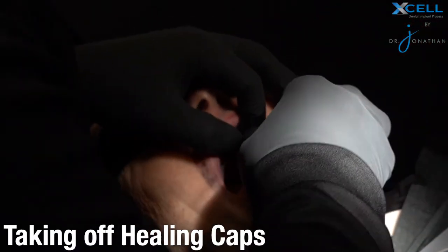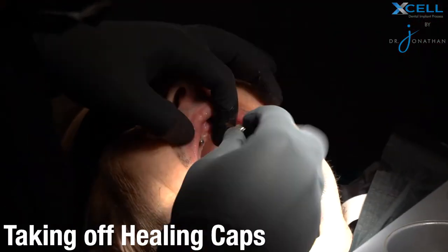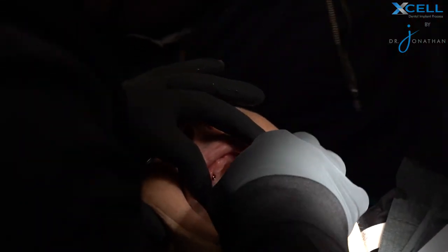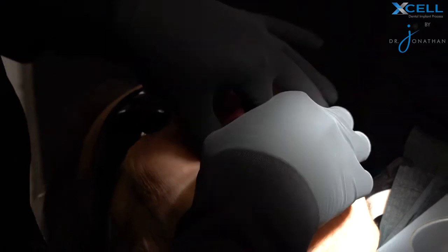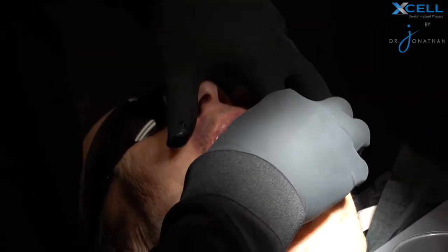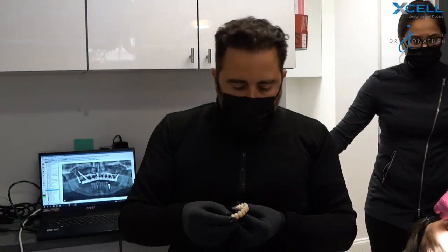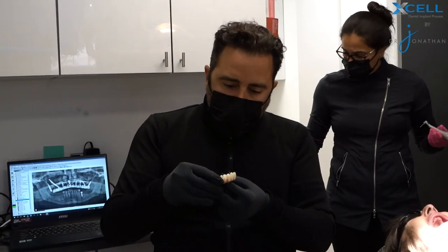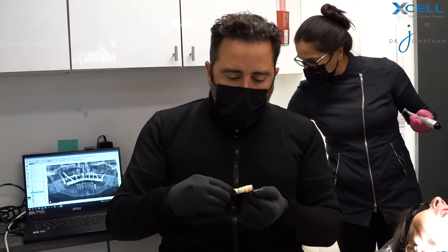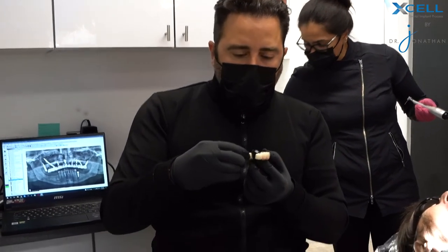Here is the prosthesis, fully made all in-house by me, colored by me — powerball screw, no tie base, no metal, super strong and polished.